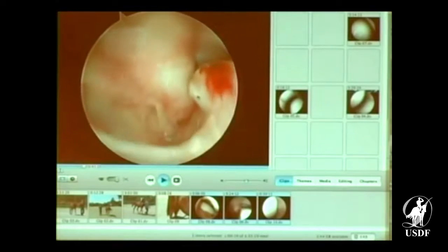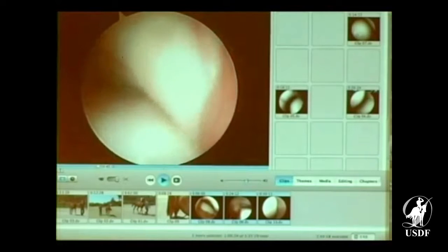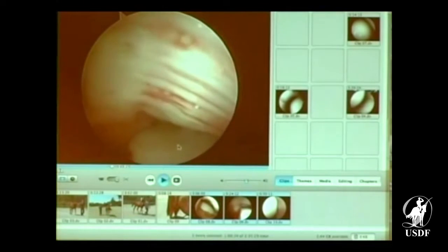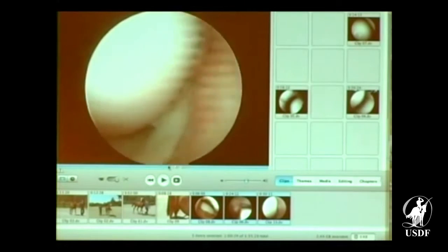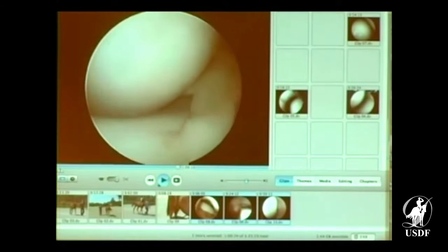There's the patella. This is the lateral femoral tibial. There's the meniscal ligament. There's the condyle here, the lateral condyle. And then come over to the medial. There's a beautiful view. Whoa, stop there. There's a beautiful view right there of the meniscus. There's the medial meniscus. There's the condyle.